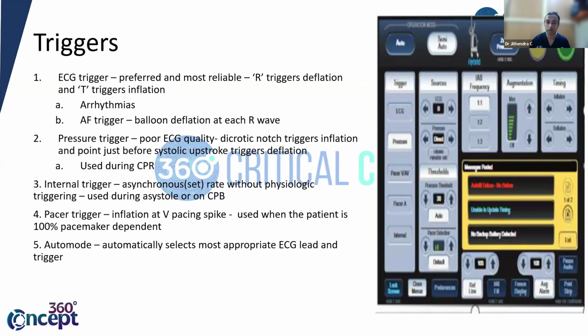If there are any arrhythmias, what to do? Some newer consoles will go ahead even with significant arrhythmias. If the patient develops AF, which is irregular, no need to worry. Some newer consoles have an AF trigger also. If the patient was in sinus tachycardia or sinus rhythm till now and suddenly develops AF or some tachyarrhythmia, no need to panic.